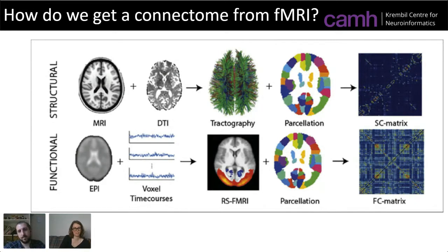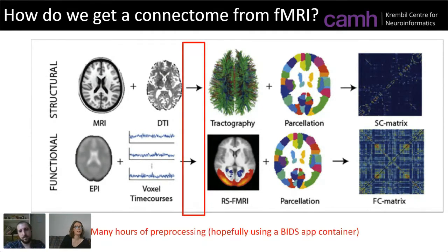I wanted a precursor here by saying that this arrow, which in this picture is an arrow, is hours and hours of preprocessing, usually.